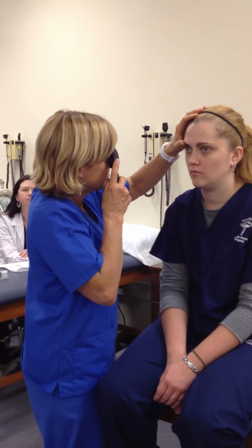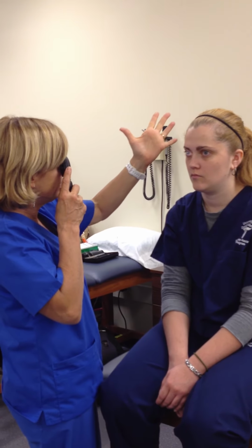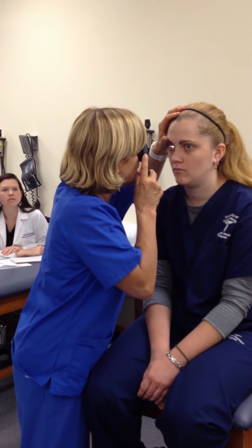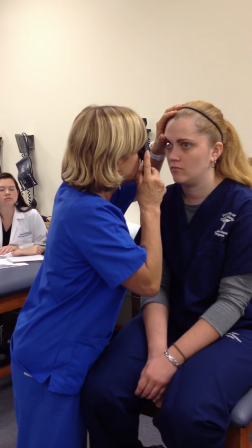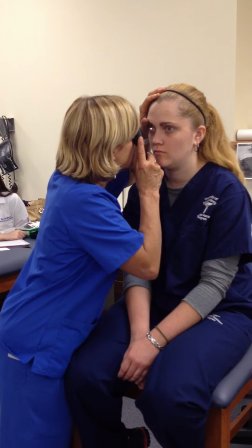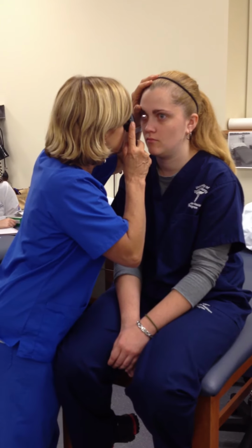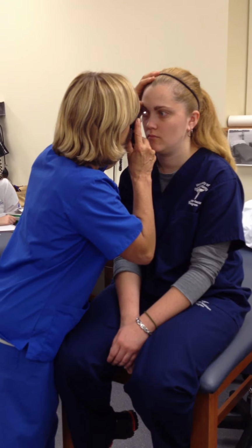I'm just going to stand out here, and the first thing I'm going to do is see a red reflex. If I'm away from the patient, I spot that red reflex, and then I'm going to keep this right next to my nose. I'm going to come in close, hold, hold, hold. Once I see a vessel, I'm going to move my diopter to try to get it in focus. Come in. And then from here, I'm going to look up in all my quadrants. I'm looking at the vessels, I'm looking at the discs, I'm looking for any hemorrhages or exudates. Would you look right into my light just for a second? Perfect.